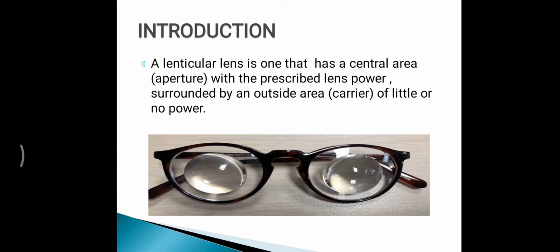Many of us think that the lenticular lens is outdated and not required, but it's not like that. In such conditions, we need lenticular lenses. Sometimes if it's a high prescription, you have to go for a higher index like 1.74, but the patient cannot afford that much money, because if you go for a higher index you have to pay more. But in such cases you can go for lenticular lenses. So we'll discuss this.